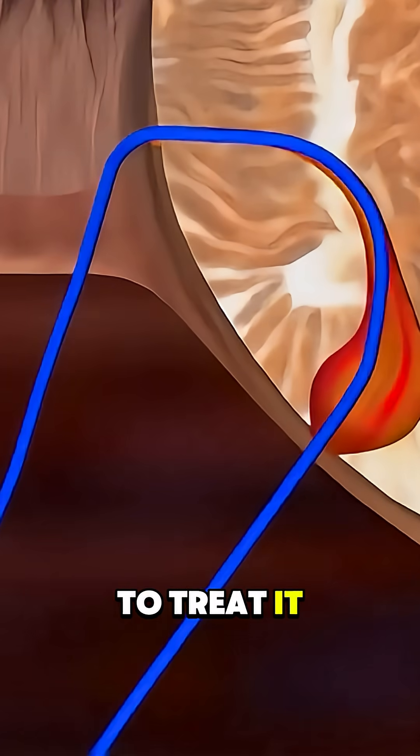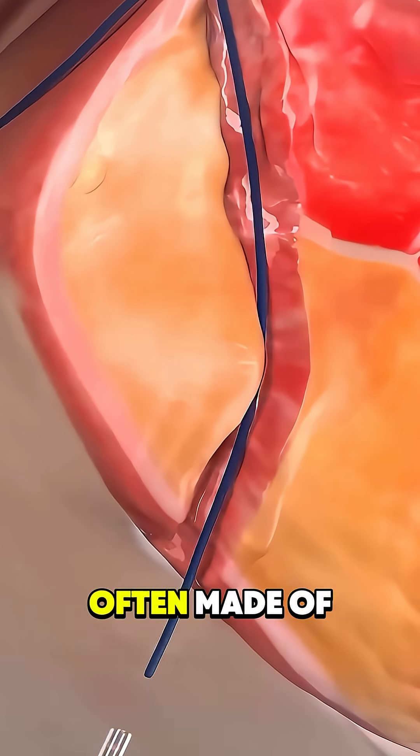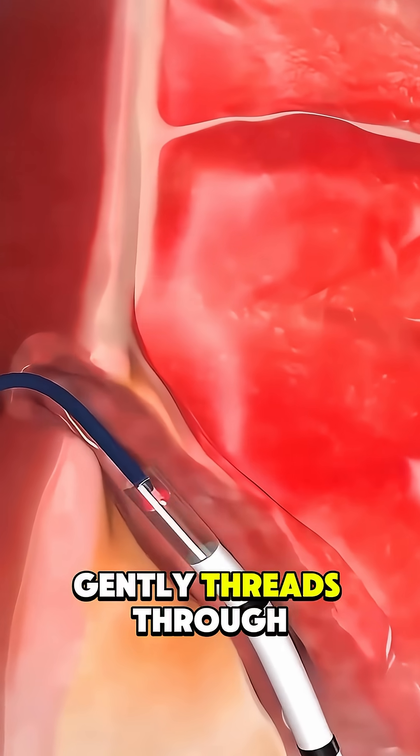One common way to treat it is with something called a seton. A seton is a soft, flexible loop, often made of rubber or surgical thread, that the doctor gently threads through the fistula.